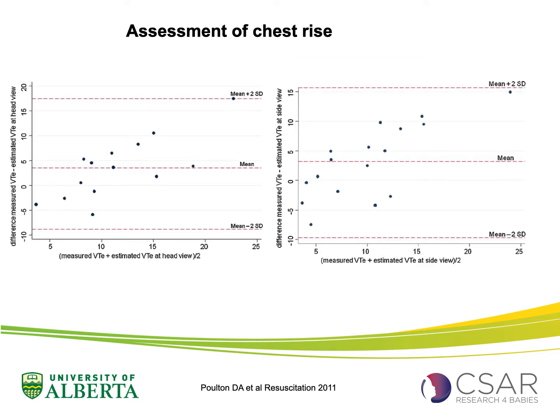Now, you could argue, okay, it's hard when you stand at the head of the table, but what is happening when I stand at the side of the table, like when I have the junior trainee at the head, and I am the attending at the side observing the whole situation? I have to disappoint you. Regardless of whether you are a junior trainee at the head of the table or an attending with more than 20 years of experience, your assessment of chest rise is as bad or as good as ever you want to put it. So in summary, it doesn't really matter, because you're unable to assess chest rise in those premature infants.